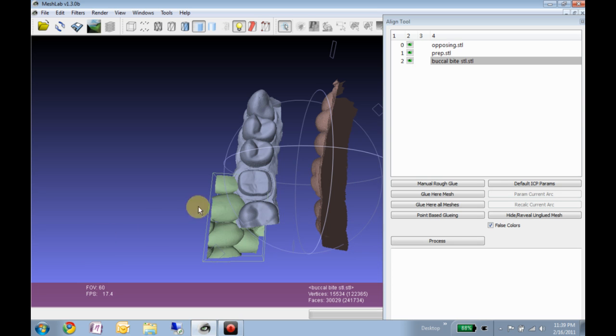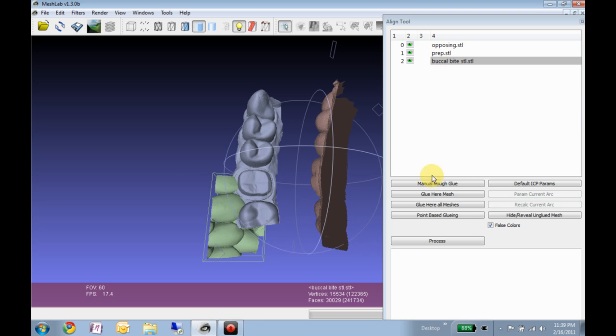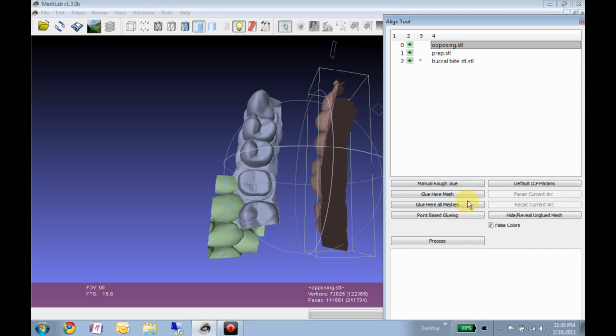But for three models such as these, which were taken in different instances and kind of randomly in space, the first thing we want to do is rough them into place.